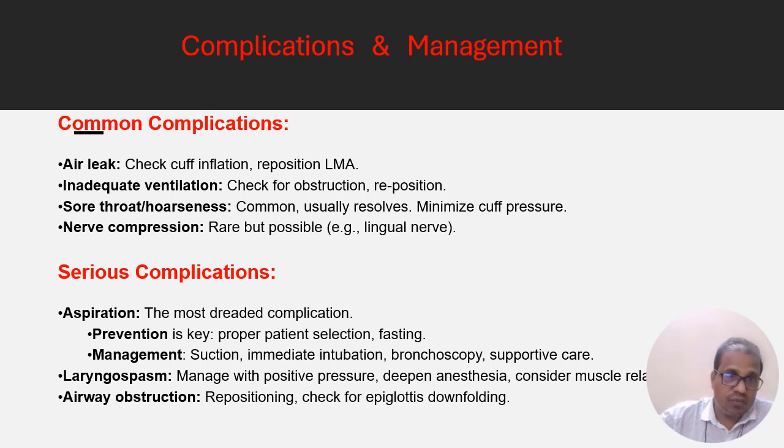Seriously, if accidentally the cuff is inserted in front of the epiglottis, then the epiglottis can block the laryngeal inlet fully, and there is a chance of airway obstruction. We will have to check and recheck in this situation and manage accordingly.